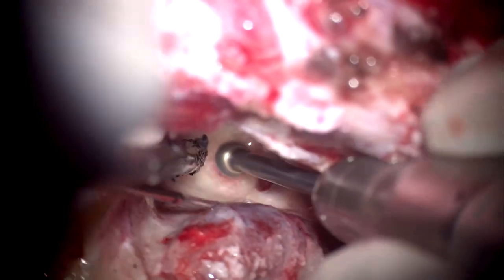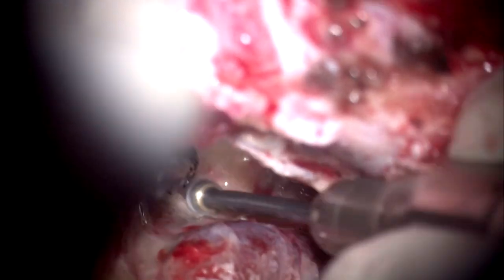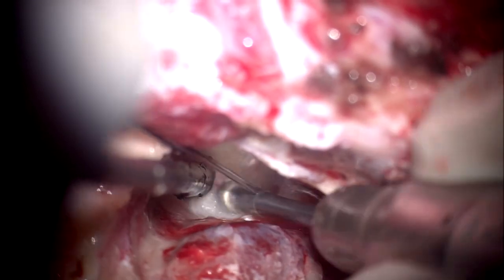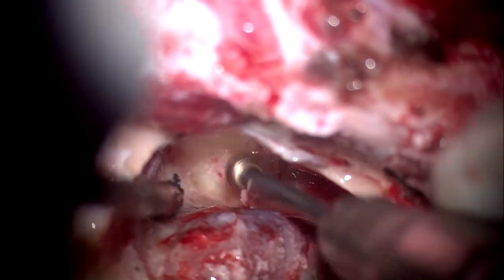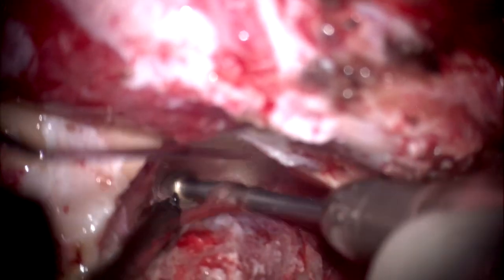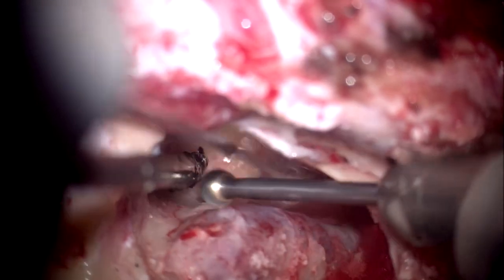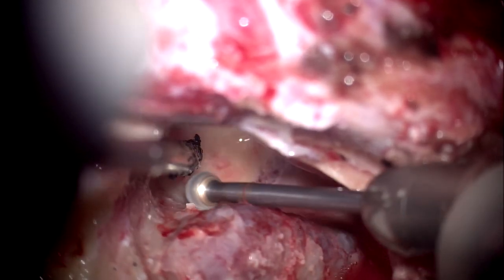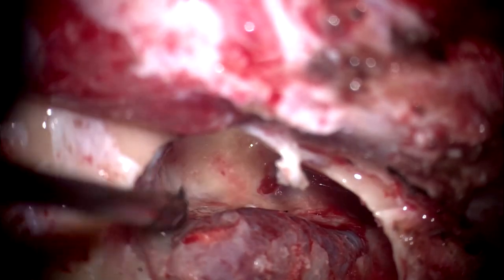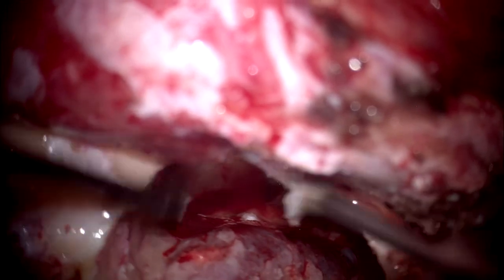My maximum bone work, quick bone work, is done. This is the additional safety that I have kept the bone over the sigmoid. I can remove it right now, but as long as I keep it, it is additional safety that my burr point is not going to go into it. Ultimately, I have to remove it. And you know, if it obstructs too much, you can remove it early.